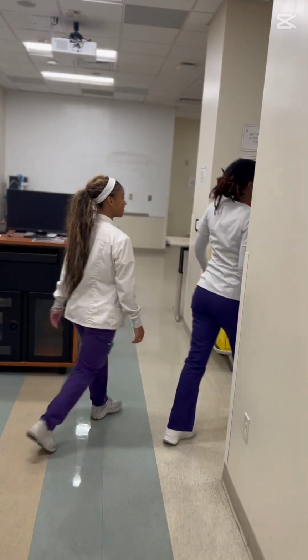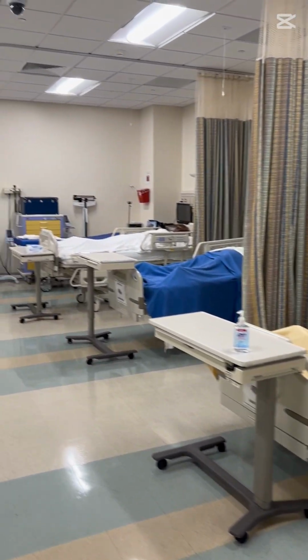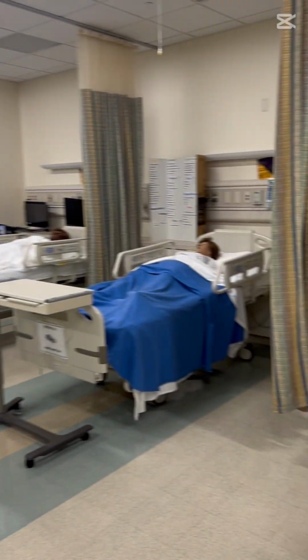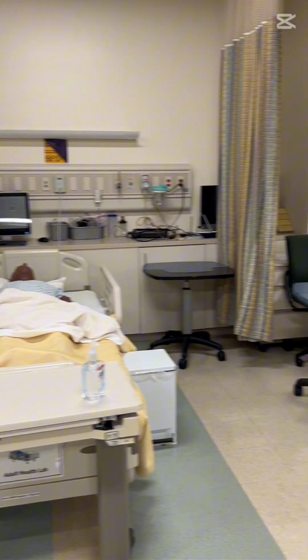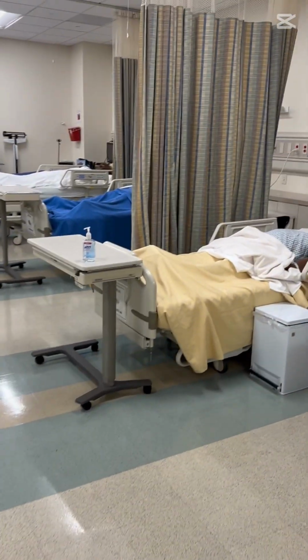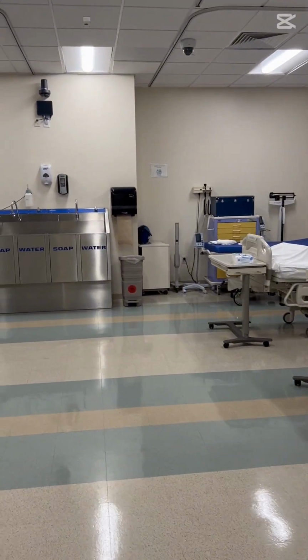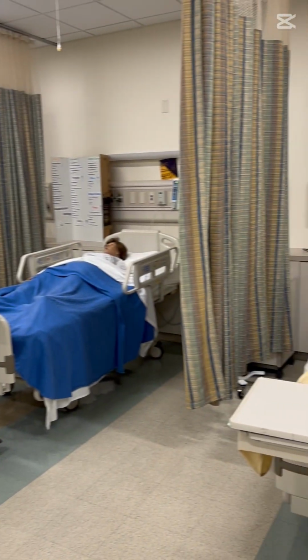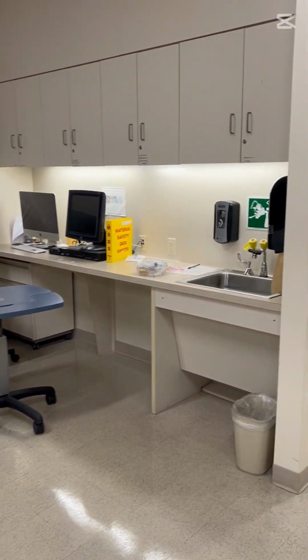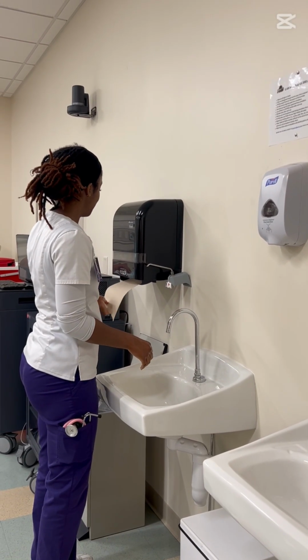We will be performing an arterial blood gas draw, also known as an ABG. This procedure involves collecting a small sample of arterial blood, most commonly from the radial artery, but the brachial artery can also be used. This is used to evaluate a patient's acid-base balance, oxygenation, and ventilation status. In simple terms, ABG helps us to determine how effective the lungs are moving oxygen into the bloodstream and removing carbon dioxide. We will first start off by washing our hands, introducing ourselves to the patient, and getting their age, name, and date of birth.